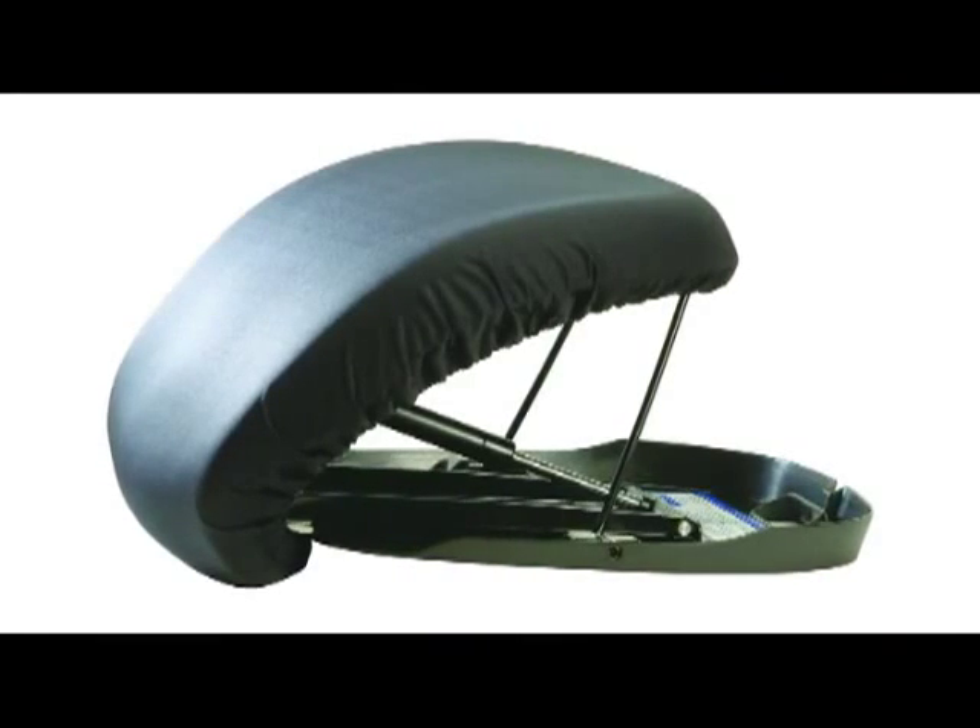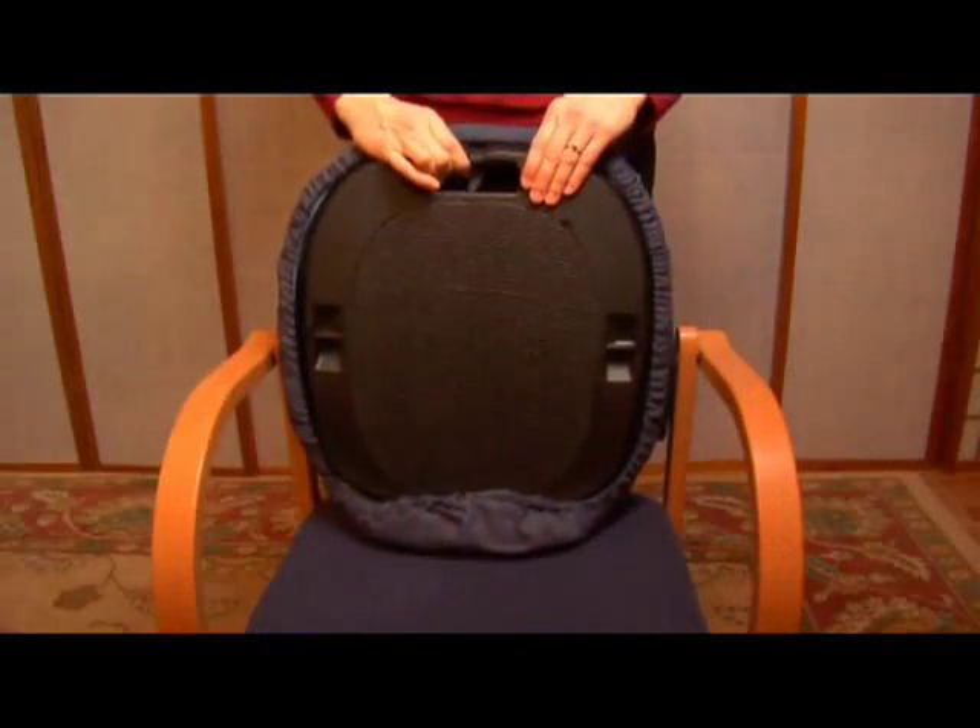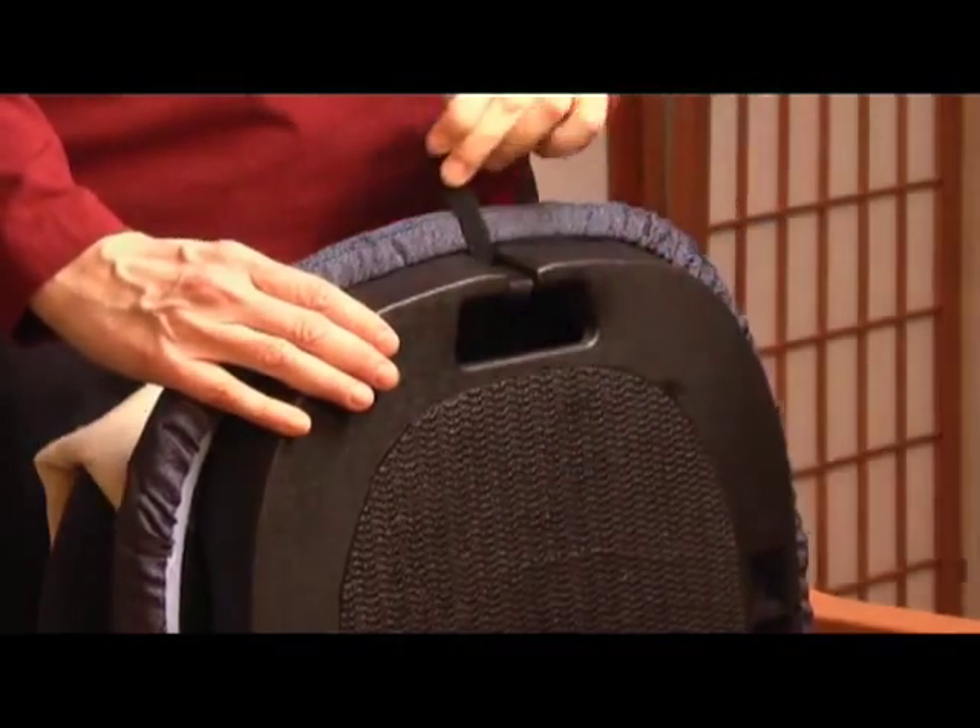With nothing to plug in, the Seat Assist is easy to use. One of the benefits of this product is it's portable, and the nice thing is that you don't have to have a lot of room to use it.